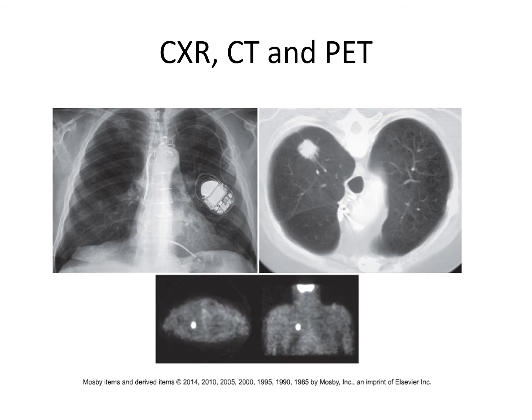And PET scans, I'm trying to see if I have notes. My slides are a little bit out of order from what I'm viewing here, because I redid this PowerPoint a while back and I'm trying to match up my notes. PET scans, I know they give to help detect cancer, and for some reason I can't find what I'm looking for right now, but what they do is they have the patients fast.